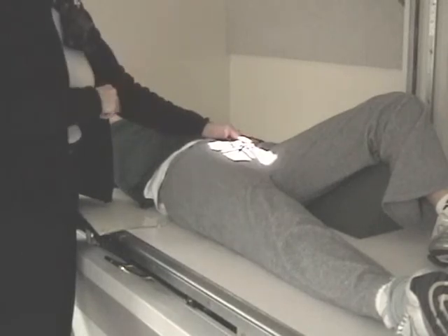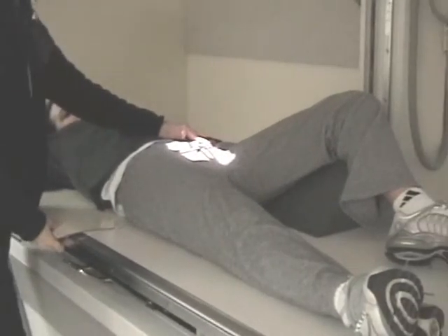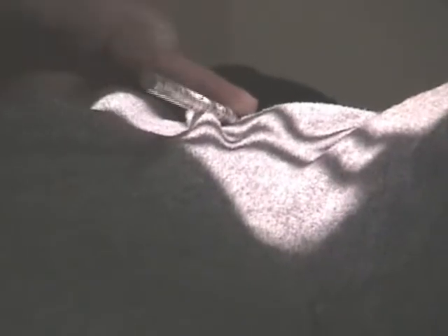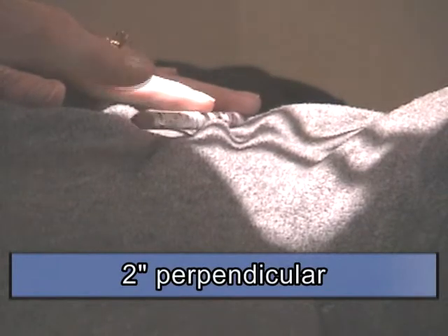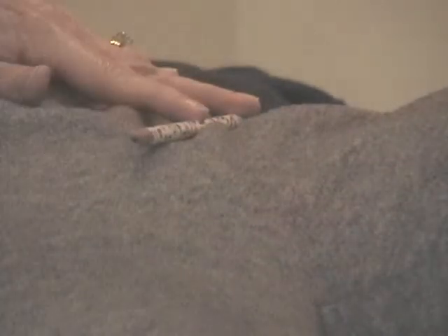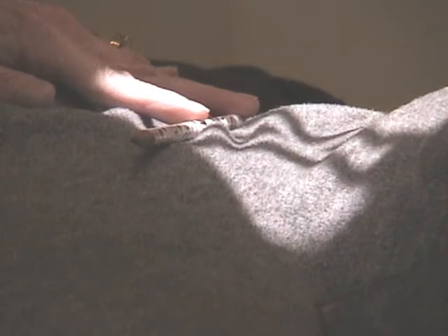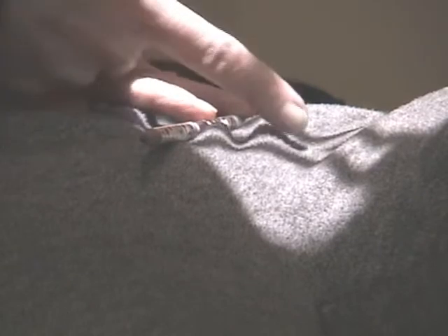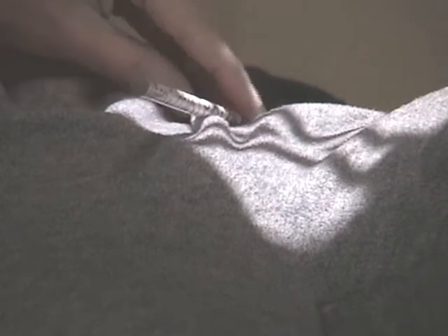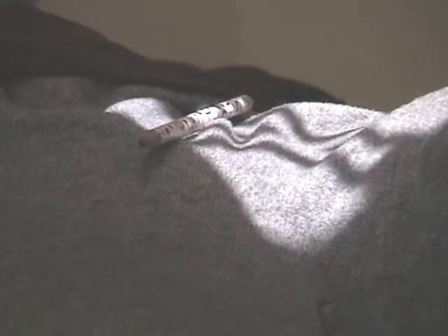And if the camera can focus in on what I'm doing here, here's my imaginary line, and I bisect that line, and I'm going to be 2 inches perpendicular. The pencil is to outline that imaginary line. Bisect means to cut in half and go perpendicular, and I want to be 2 inches below that imaginary line. That will put the hip right to the center of the film. Okay. Now, I put the pencil on her body a little bit more than I normally would; it's for demonstration purposes.